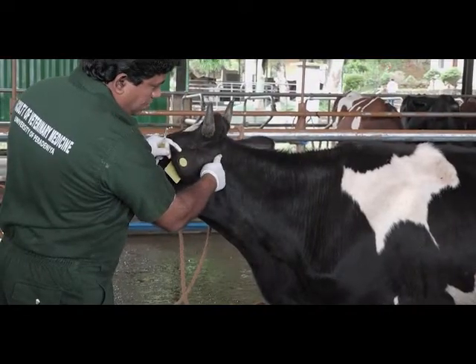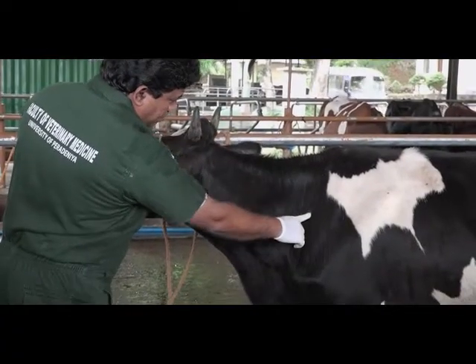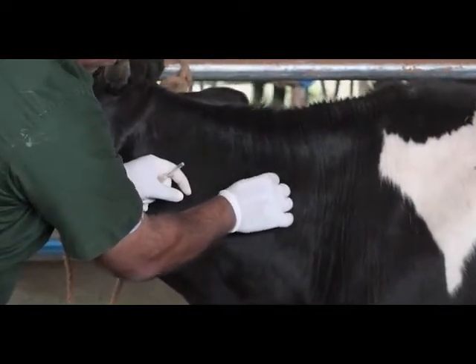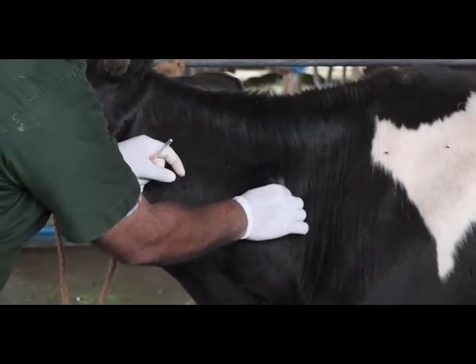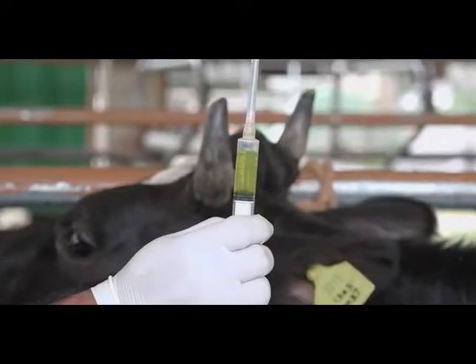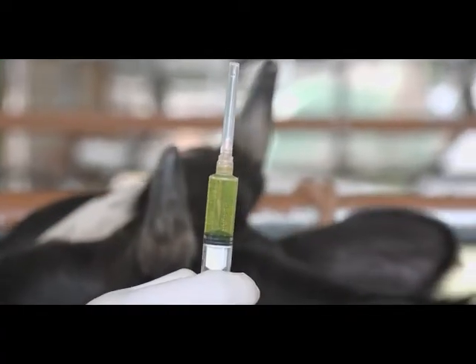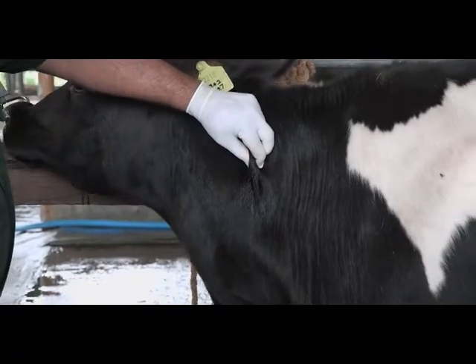Similar to IM injections, subcutaneous injections can be administered at the injection triangle of the neck region. Disinfect the skin as previously described. As previously demonstrated, the drug should be loaded to the syringe. Make a skin fold by lifting the skin up.